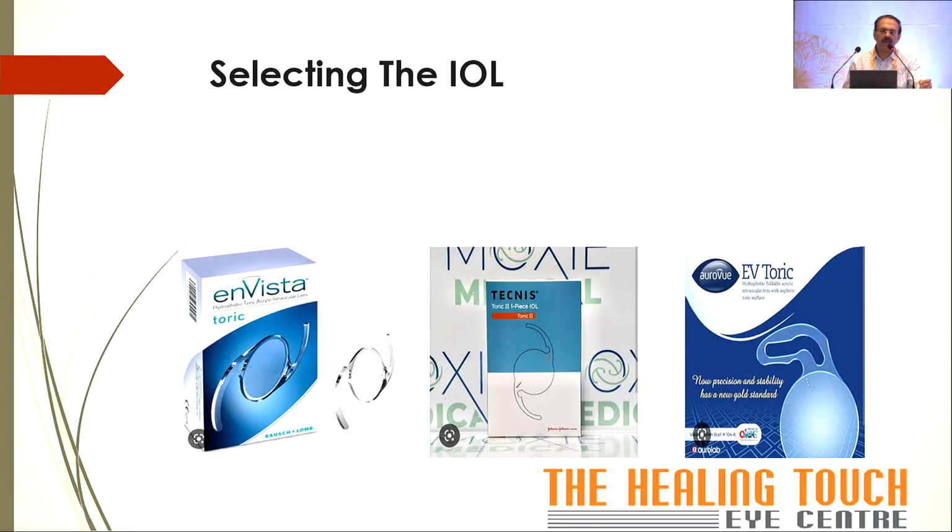Like if I am doing an eye which is post-refractive, which will not have the right A constant value, it would be best to choose an IOL which has zero asphericity, like the Bausch & Lomb Envista and the Auroview toric lenses, which have zero asphericity, and most of the lenses like the Technis Pure C come with minus 0.27, which neutralizes the normal asphericity of the cornea.